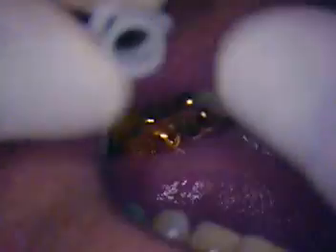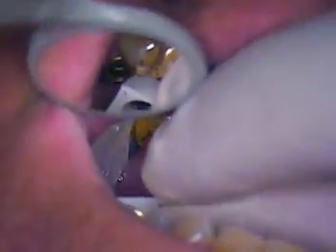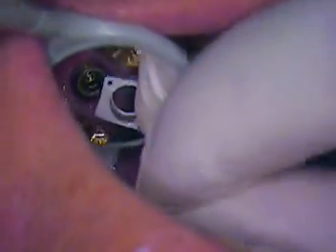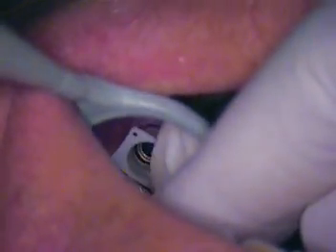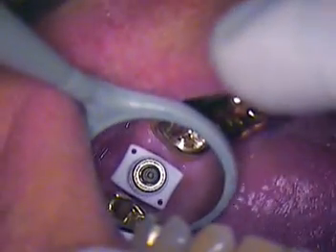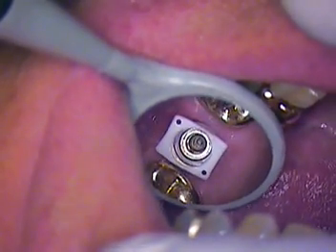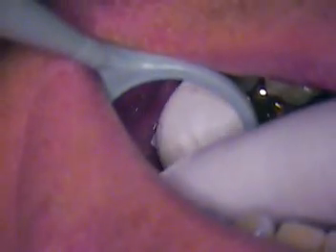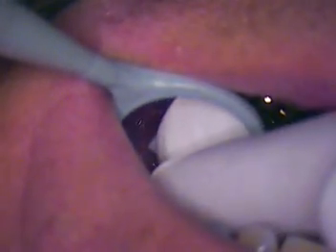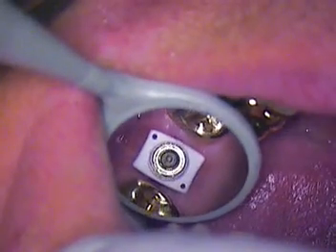Okay, so here we go. This is a little snap-on device, snap-on rim. So we're going to set it in position and make sure it's aligned properly. Now see right away it's pretty close to that mesial aspect of 15. We just want to make sure it doesn't come into contact. So I'm going to push on that straight until we hear a snap. There's a snap. Alright, so looks like we're almost dead on.